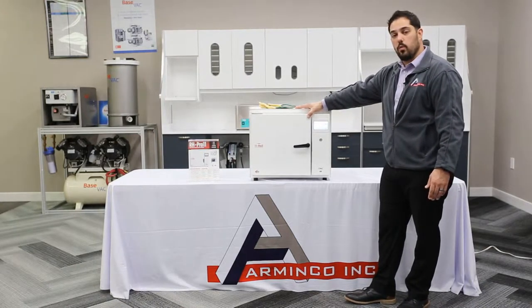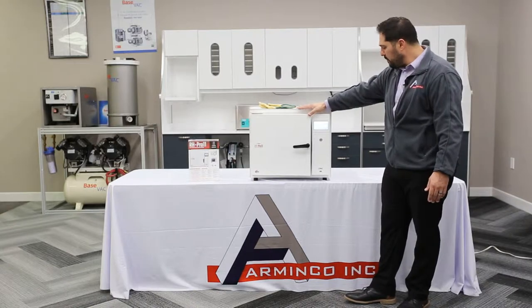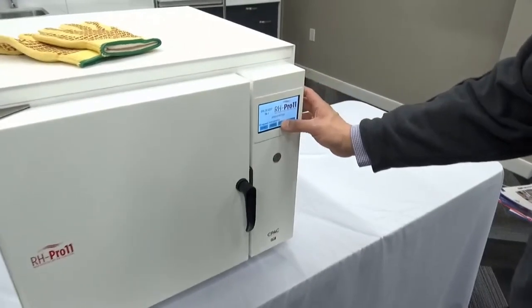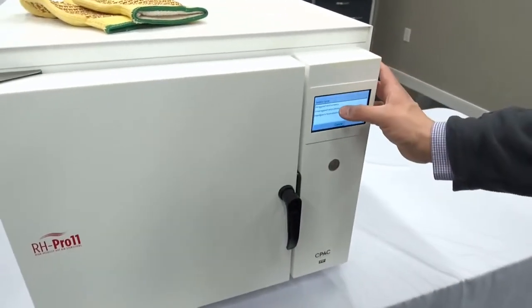The units come with a two year manufacturer's warranty and are very easy to operate. The menu selections are very simple, very intuitive, and easy to understand — there's no adjusting required.